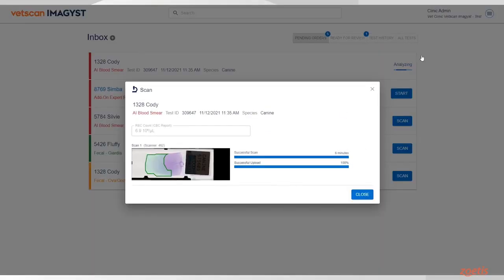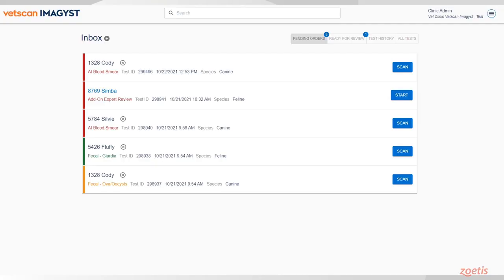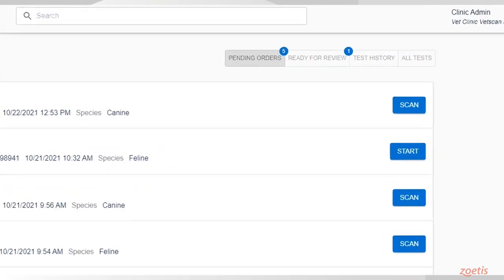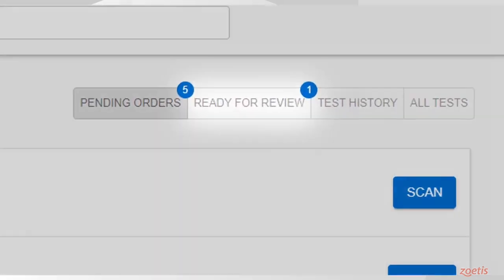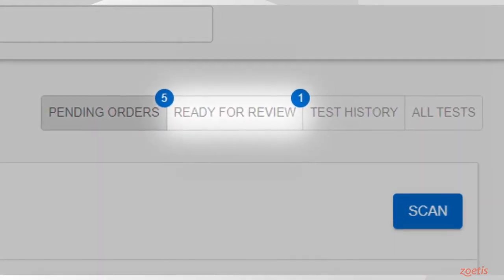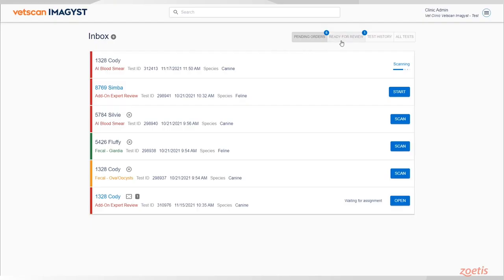At the top of the Inbox, you will notice four tabs. One is labeled Ready for Review. When the AI report is finished, the result will appear under this tab.